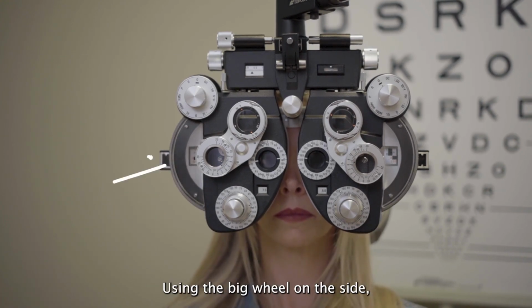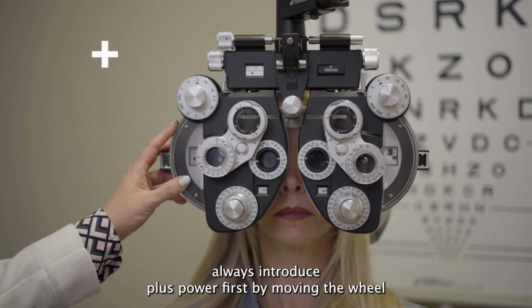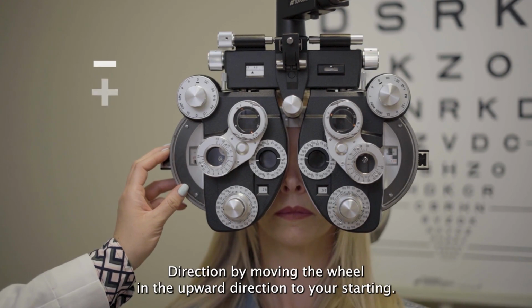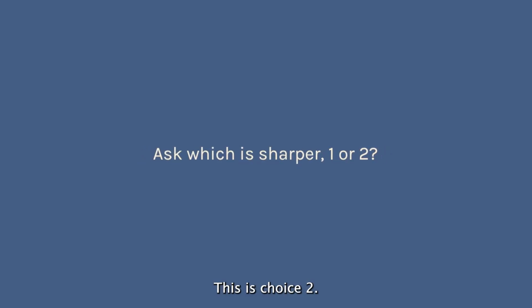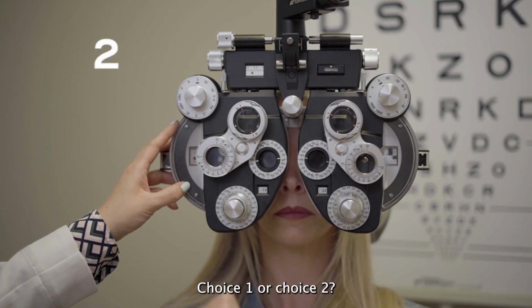Using the big wheel on the side, always introduce plus power first by moving the wheel in the downward direction. Move the dial down a click. This is choice 1. Now move in the minus direction by moving the wheel in the upward direction to your starting position. This is choice 2. Ask the patient, which is sharper and easier to see, choice 1 or choice 2?